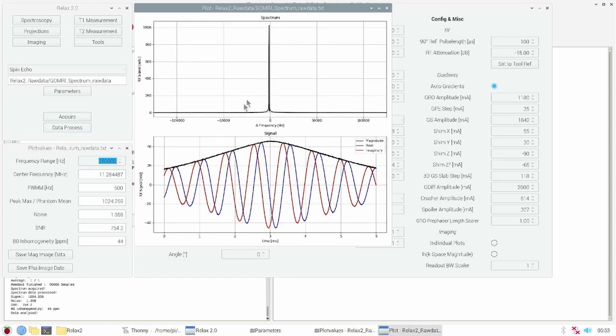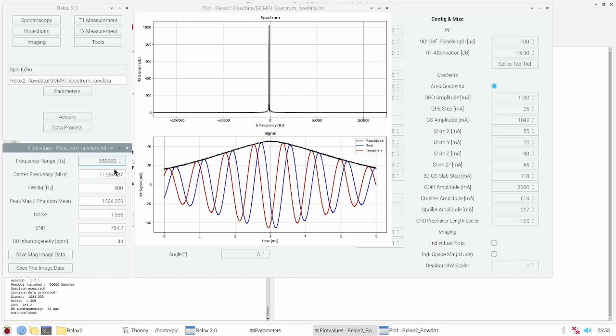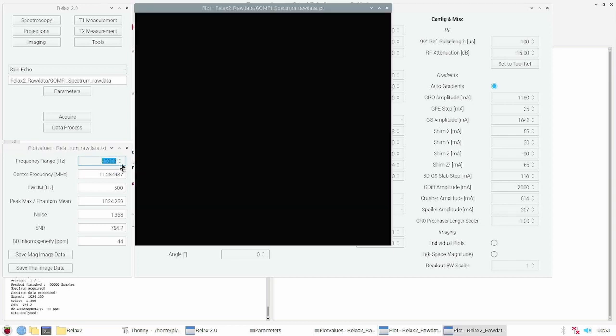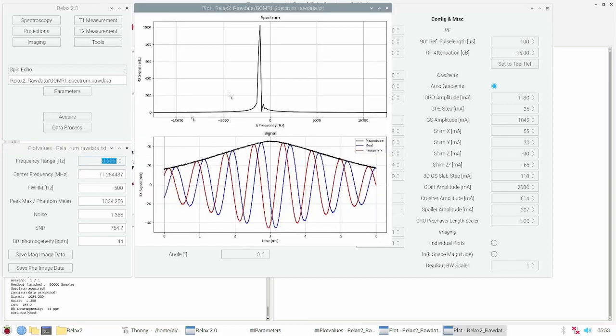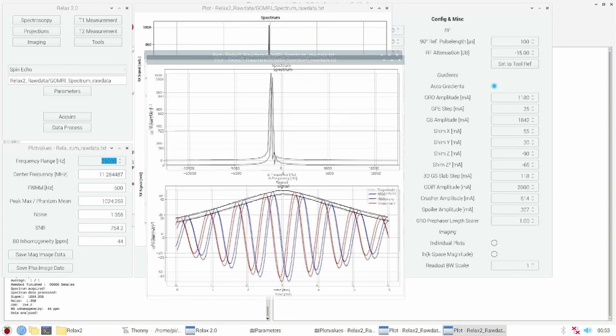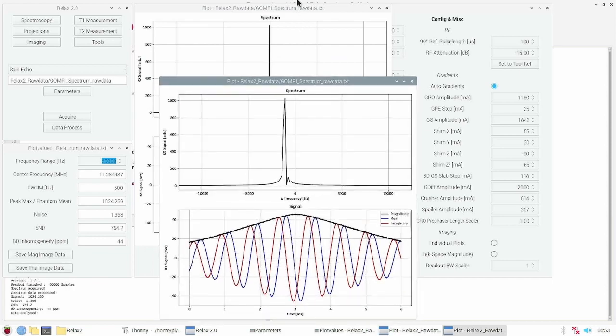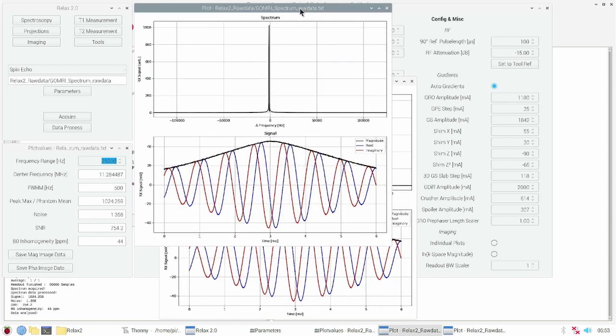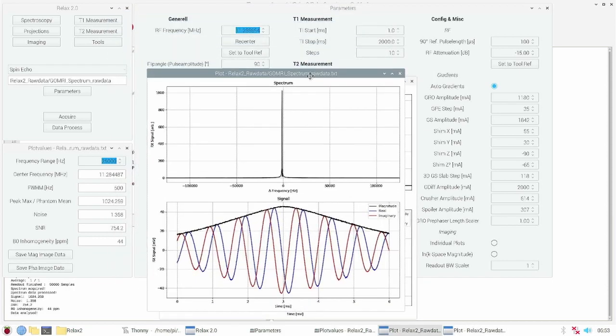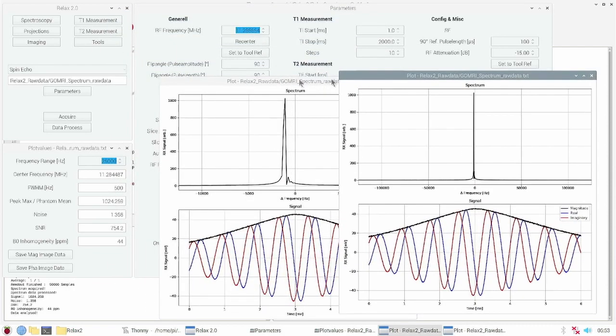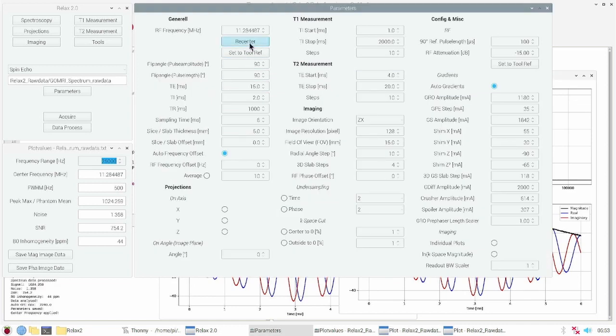We see our signal peak in the frequency domain. We can zoom in into this frequency domain and we will see that the peak is slightly offset from the transmit pulse.